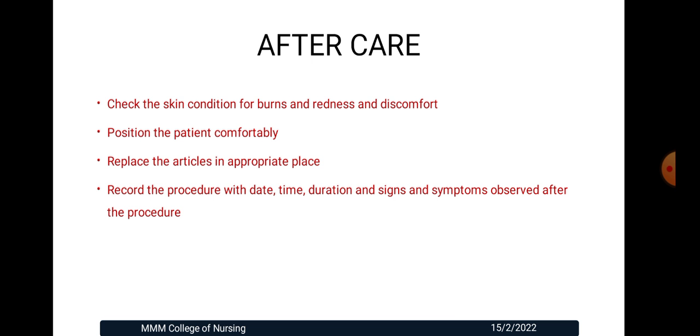Aftercare. Check the skin condition for burns, redness and discomfort. Position the patient comfortably. Replace the articles in the appropriate place. Record the procedure with the date, time, duration, and signs and symptoms observed after the procedure.